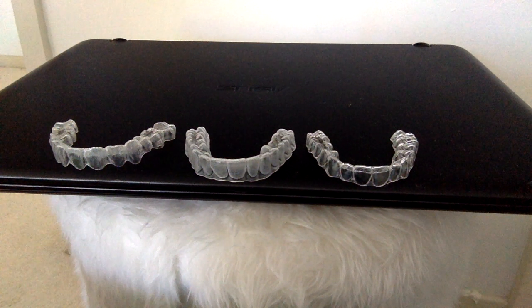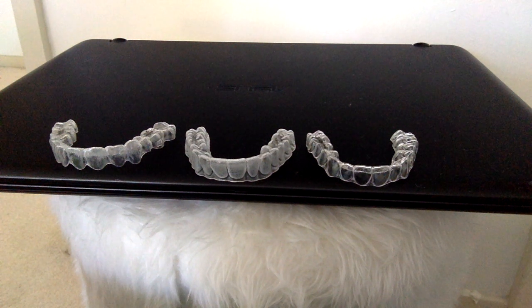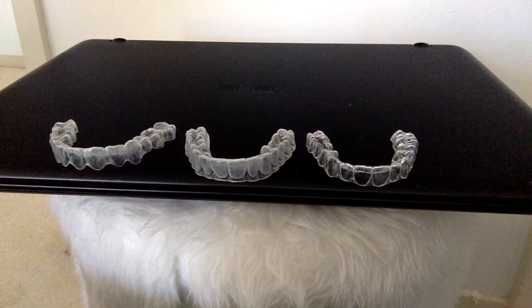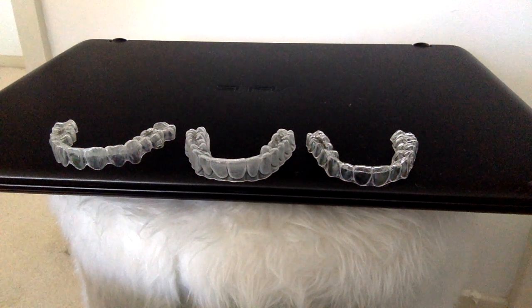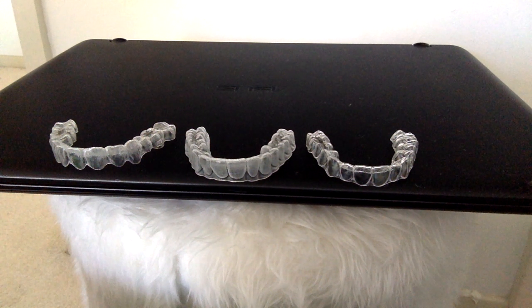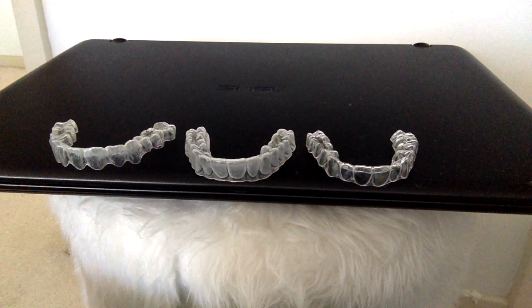But in any case, just from face value, what does it look like? You can kind of see there's some distinct differences in the transparency, the translucency, the opacity, the trim of the aligners. So you can see here, Invisalign does have a patented trim. I believe it's proprietary. No one else can use their trimming method. There's some benefits to this trimming. It's probably the healthiest way to have your aligner trimmed in that it's scalloped or contoured to the edges of your gums, so that those most delicate parts you can keep really clean. They can flush away any bacteria during the day.